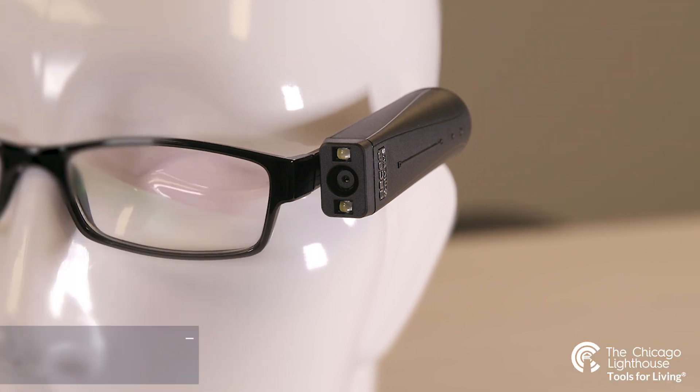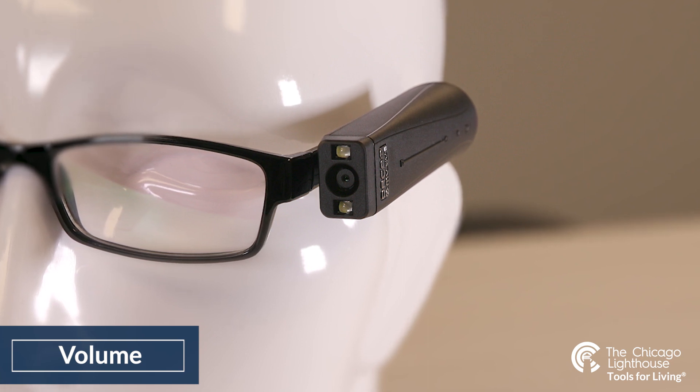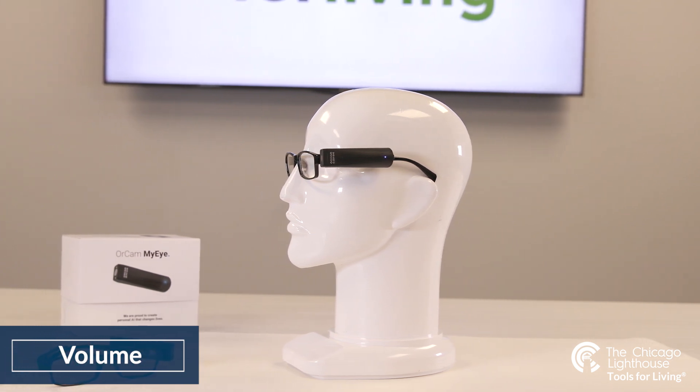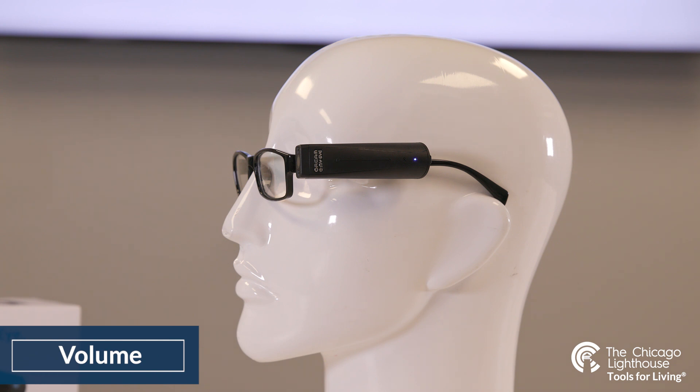The OrCam speaker can either be loud enough for those within the room to hear, or soft enough for only those next to you to hear. In addition, Bluetooth headphones or speakers can be connected to the device for private or public listening. To raise and lower the volume, swipe the flat of your finger alongside the outside as it rests on your glasses frame — swiping from the back to the front will raise the volume, and swiping from the front to the back will lower the volume.